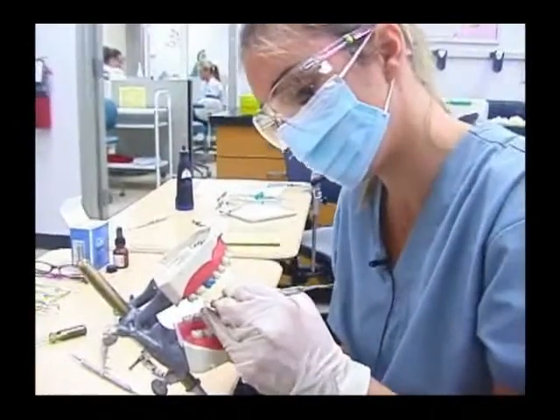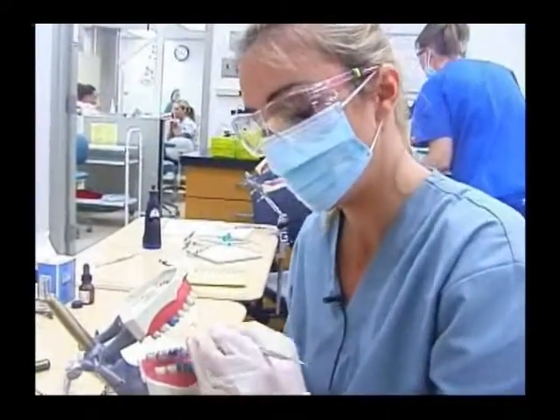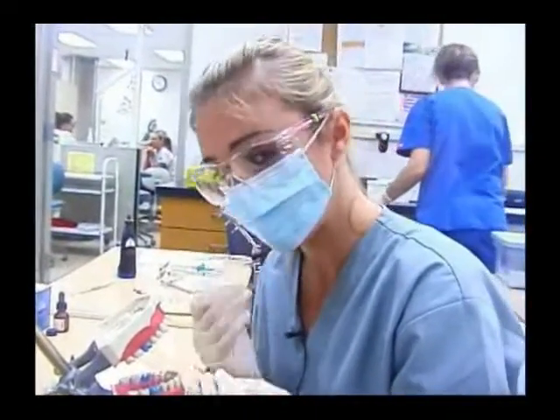You want to make sure while doing this procedure that you have all your personal protective equipment on, which are your gloves, your mask, and your goggles.